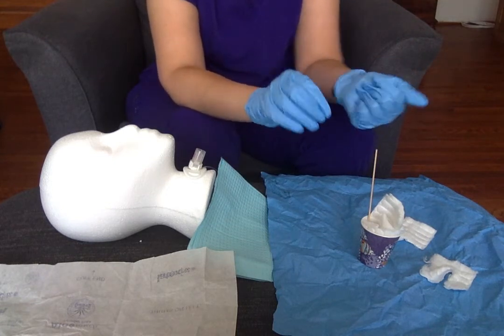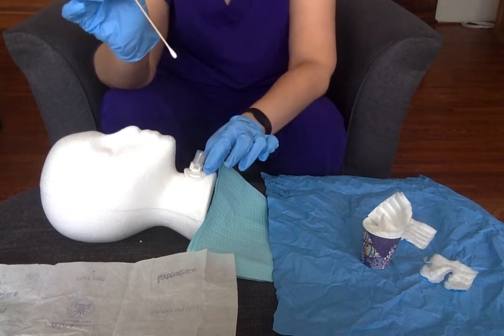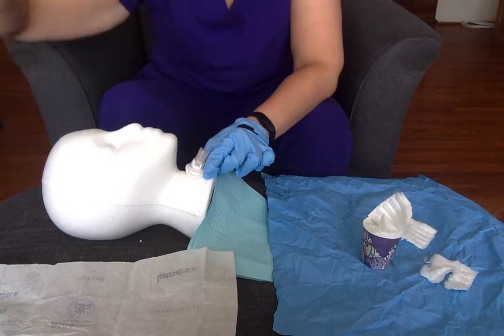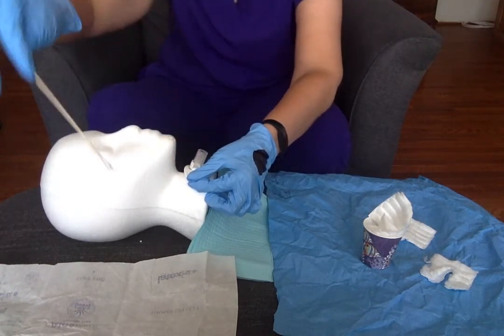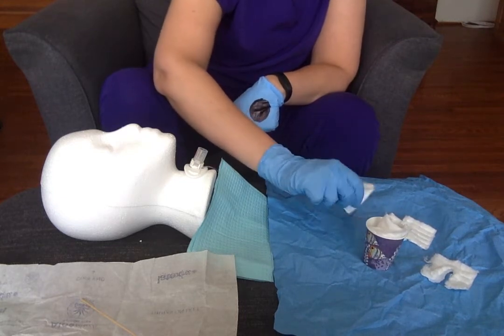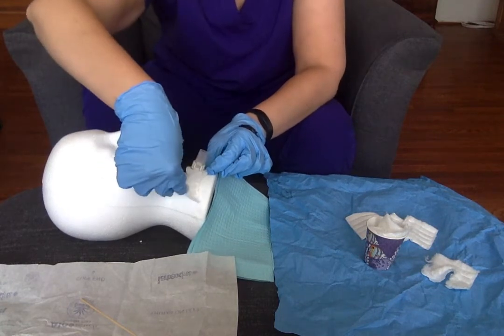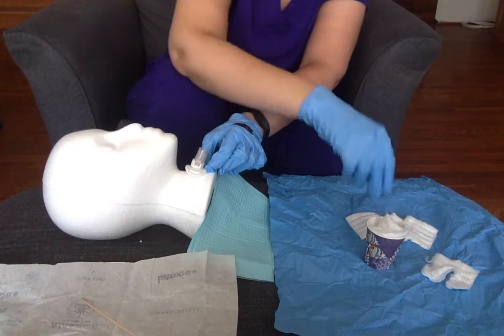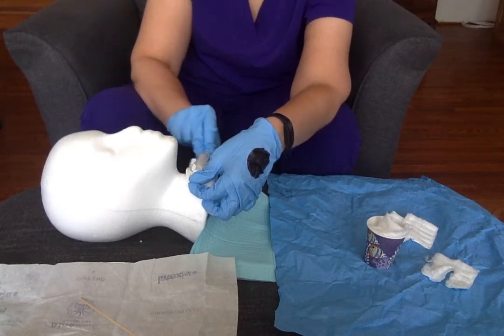The next part is to go ahead and start cleaning. I'm going to remove my cotton-tipped applicator and hold it towards the end so I can keep my sterile hand sterile. This hand can stabilize the flange or face plate, and I'm going to clean underneath that around the stoma side. I would trash this one, then get a second one from my kit and clean the other side around the stoma. This becomes trash. Then I go back with my sterile hand into my sterile kit, grab one of my saline-moistened gauze, fold it up, stabilize the face plate, and use it to clean underneath the flange close to the stoma near the skin. This is now trash. Sterile hand goes back into my kit, I pick up the next one, stabilize, and clean underneath this around the stoma. This is trash.